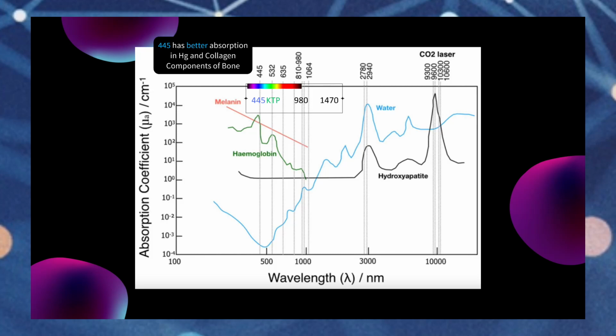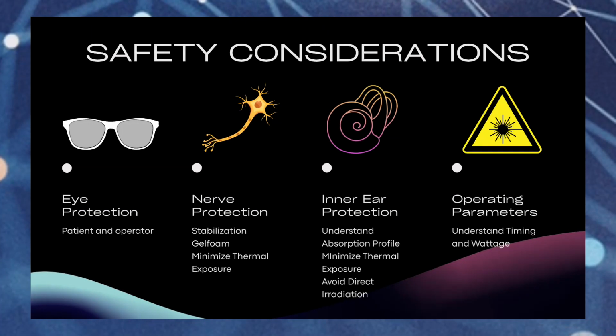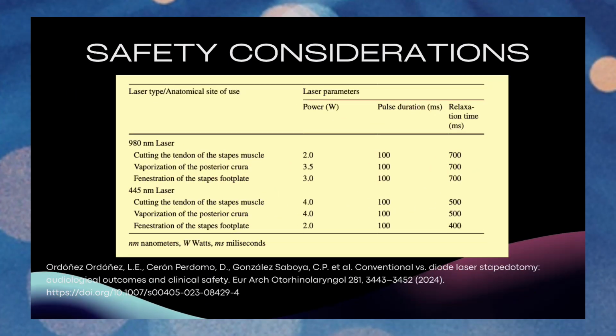It's also used in vocal cord surgery, blue laser. There are very nice techniques developed for doing office laser procedures, passing the very thin fiber through a port in awake patients, and to vaporize lesions on the vocal cords, which have some blood vessels. So it's a very effective laser, nice and very inexpensive. I think we covered most of these safety concerns already. And yes, we did. And we'll talk a little bit about the laser.